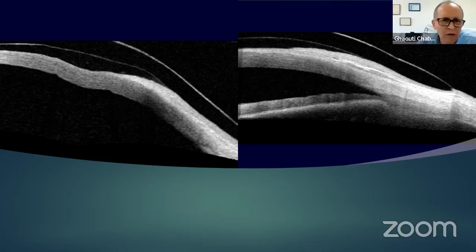So, of course, you are doing specialty lenses most of the time. You don't do general optometry. No, we don't do anything with eyeglasses. Everything we do is contact lenses, mainly scleral lenses. That's right. It's really a new development, I think. With OCT, we can see the clearance, we can see the landing, we can see everything, and we can even manage to see the angle.